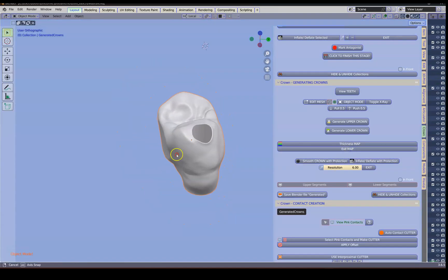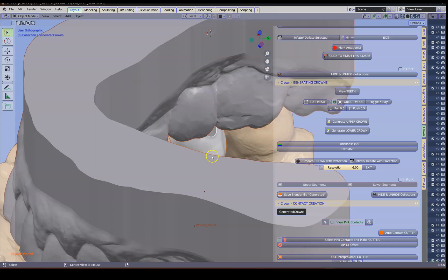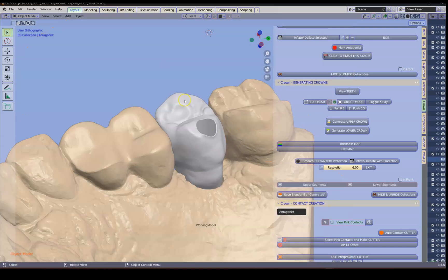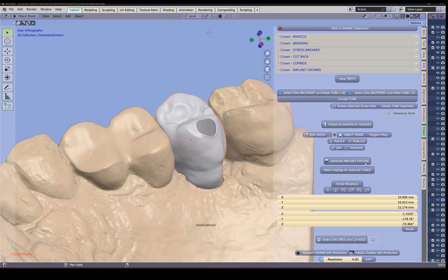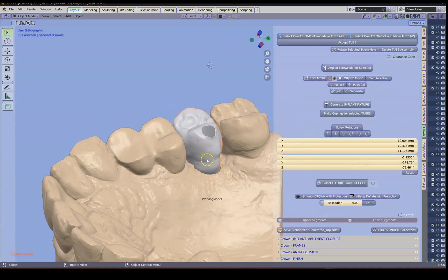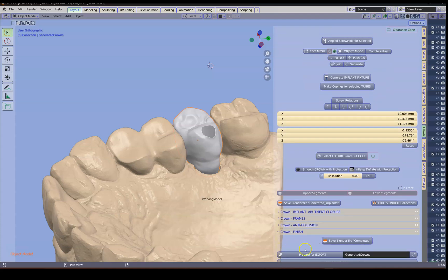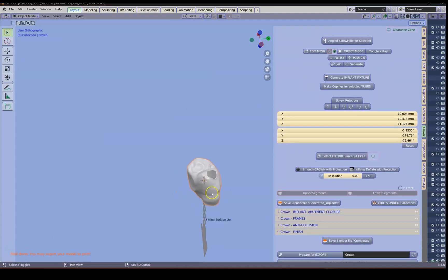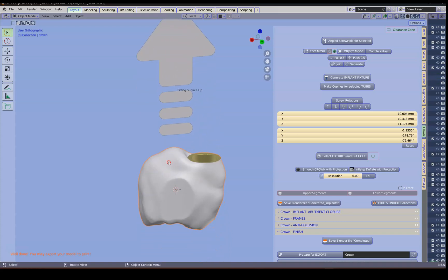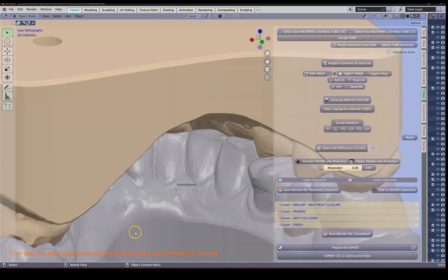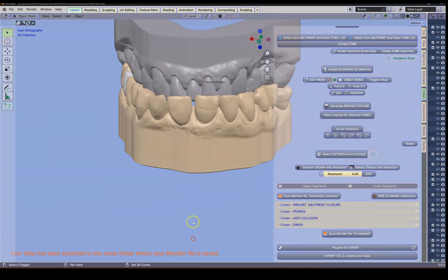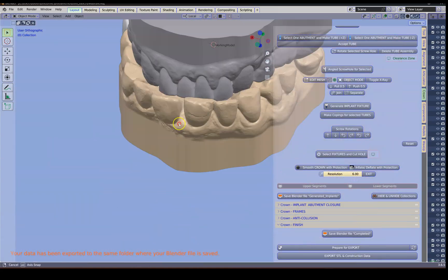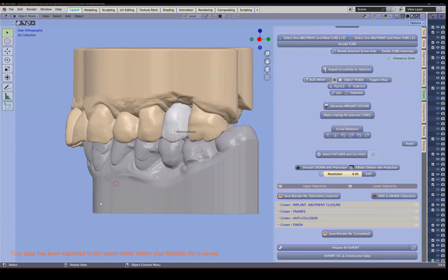And then we're going to export this crown for our construction file data. So we go finish. We're going to select this. And we're going to export the crown which will then rotate it upwards like this. And then we're going to export the construction data like that. And that finishes the video.